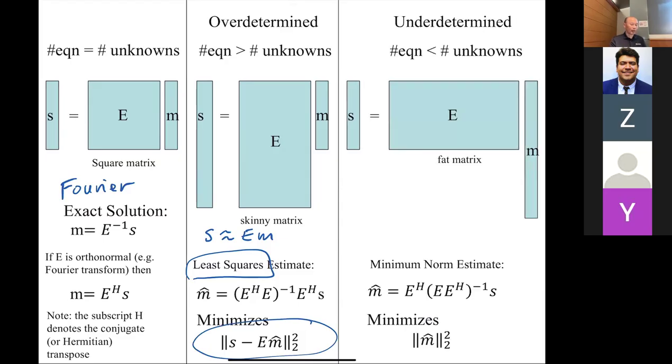And we also talked about underdetermined, where this is like where you haven't satisfied Nyquist, right? You don't have enough samples. And so this is what led to aliasing. And so the trick behind parallel imaging we talked about is to go from something that's aliased to make it something that's overdetermined. So now we can solve it. All right. So that's sort of reviewing what we did.